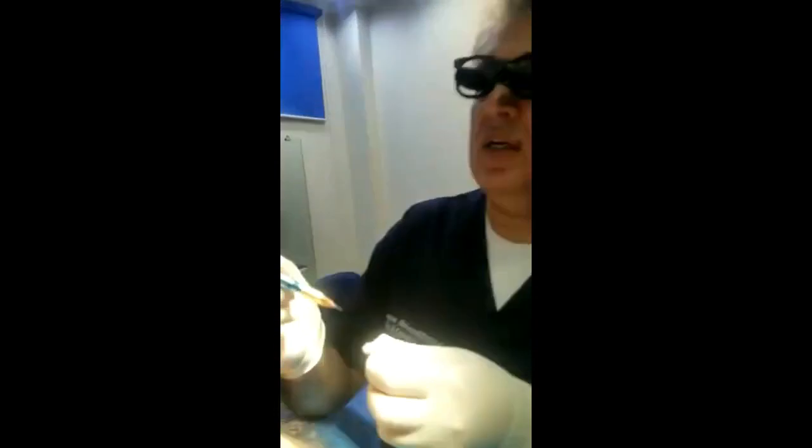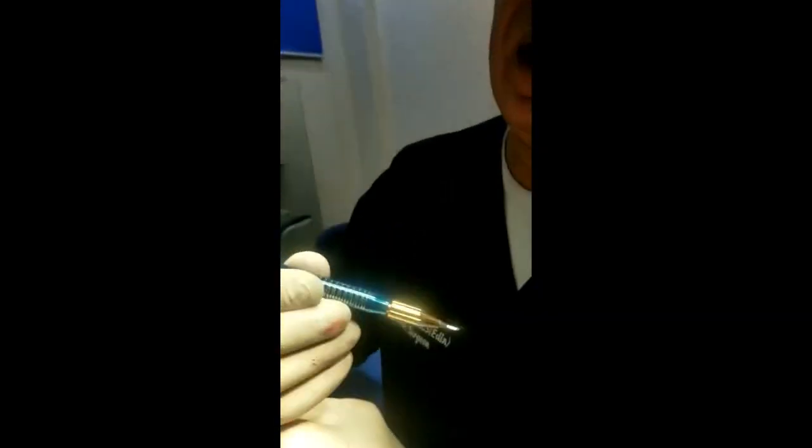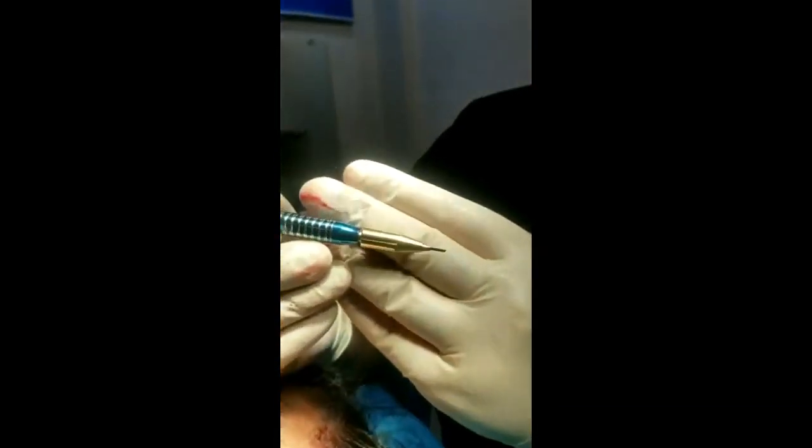So this is a blade handle that myself and Dr. Ahmed from my clinic have designed together, and it can hold this cut to size blade. These blades are different than other blades. If you see closely, it has got a beveled edge.